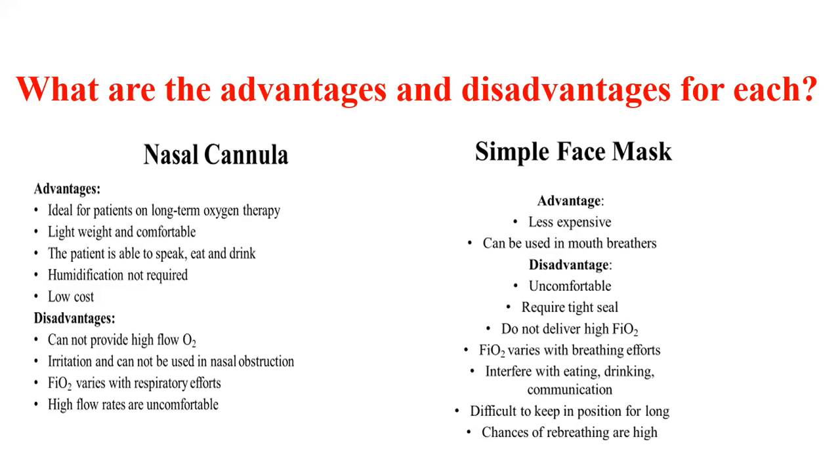For the simple mask, as with the nasal cannula, it's less expensive, and it can be used in mouth breathers, not only for the nose. Disadvantage, it's uncomfortable for the patient as long as it's covering the nose and the mouth. It cannot permit the patient to eat or to talk.